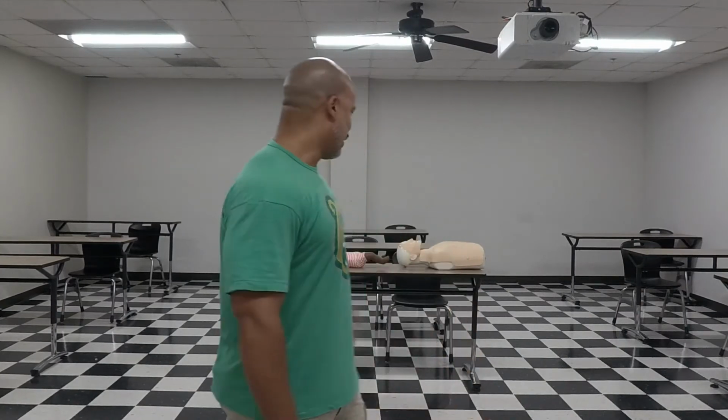Chest compressions. I've got my buddy back there. He's going to help me better demonstrate this later, but before we get started, there are a few things I'd like to say just to get you prepared for it. They are called chest compressions. That means compressions of the chest.